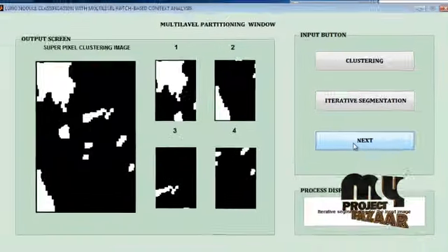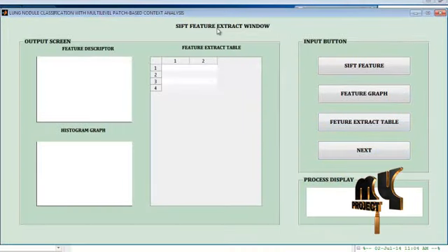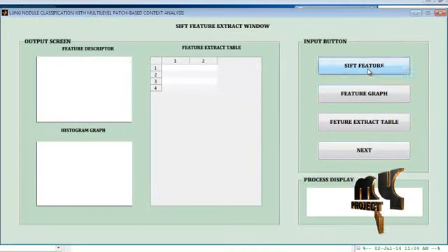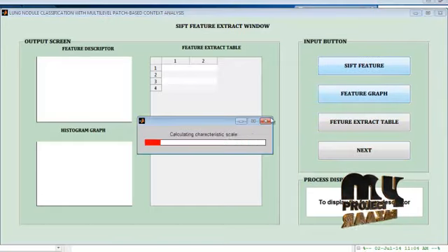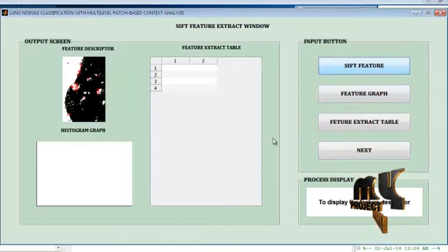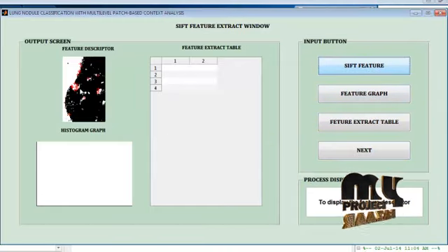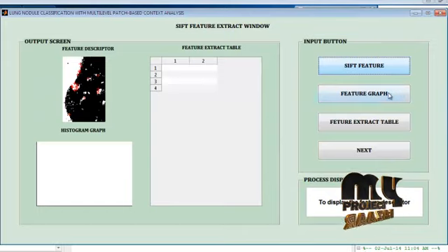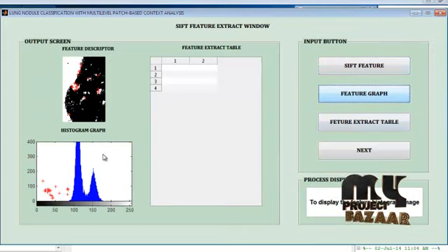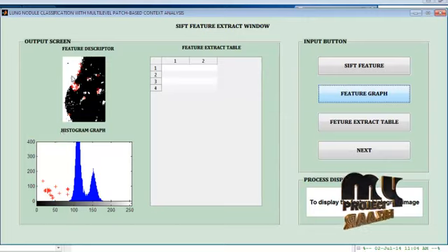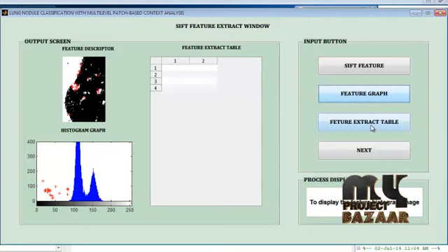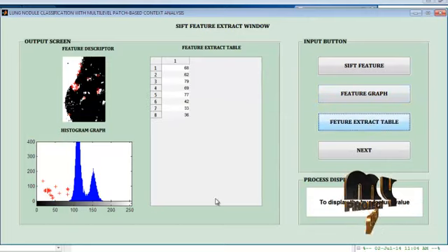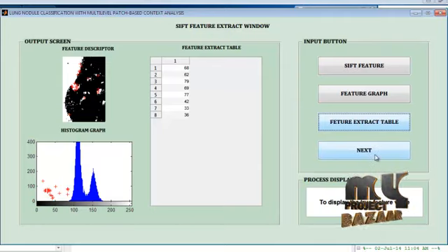The next process is the SIFT feature extraction window. This window takes the input and computes SIFT feature values, showing key points, and graphs the histogram for the SIFT feature descriptor diagram. Then the SIFT feature table for the input query image is displayed.